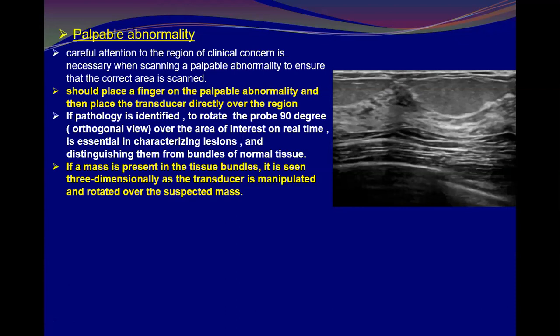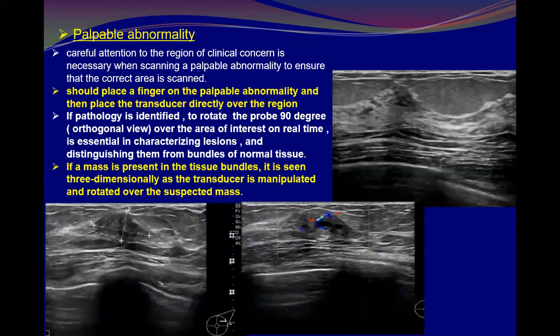It was not as small as it should be in this image. So I have to sweep throughout. When I sweep, look, within the same area, there is a fibroadenoma. Look at the same fibrous ridge. Within this parenchyma, there is an underlying fibroadenoma, which was the palpable abnormality, not the fibrous ridge itself.